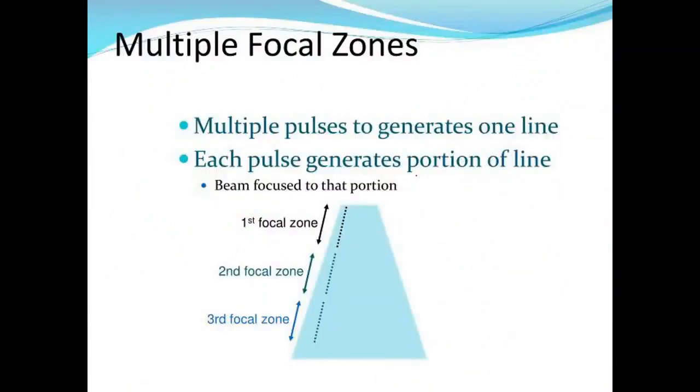You have multiple focal zones. First focal zone, second focal zone, third focal zone, and so on.